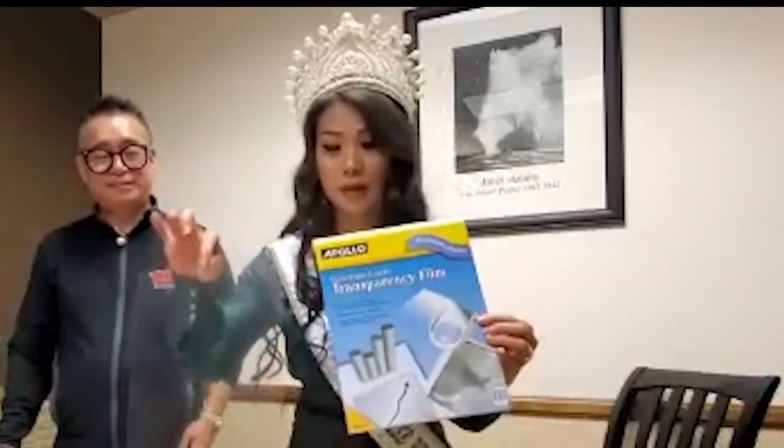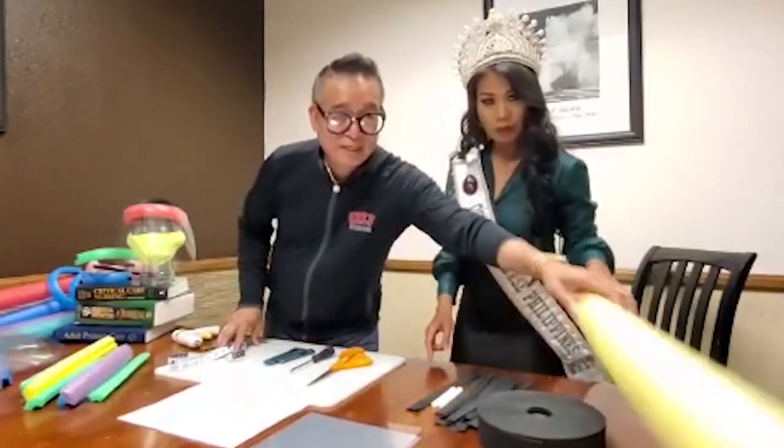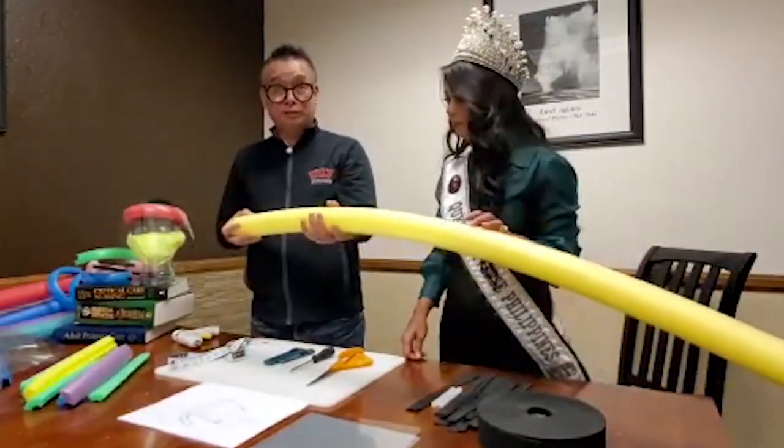So these are the materials: elastic bands or garter, glue sticks, transparency film, and noodle floaters. And these are all the equipment we need, Ness. One, we have to have a measuring tape. And then we have, of course, the scissors. Then you could use any drivers, I mean, Phillips drivers, just because we push it in. And various sizes or just one of the cutters. And the most important thing that glues it all together is our hot glue sticks or glue gun.